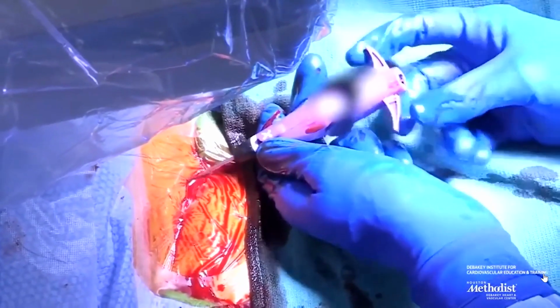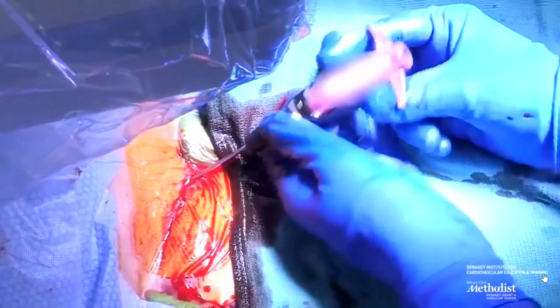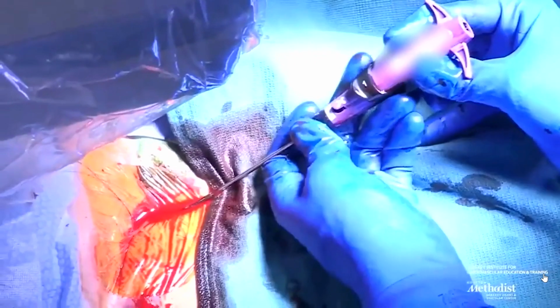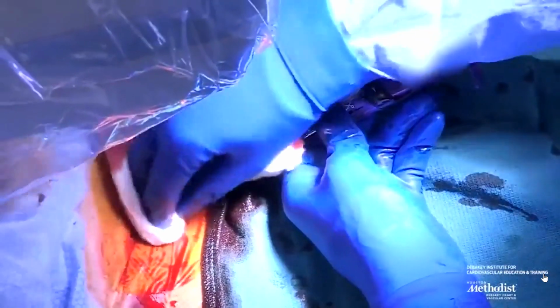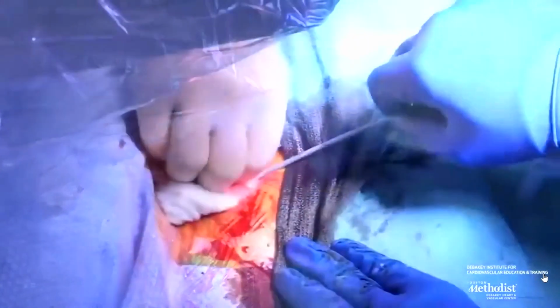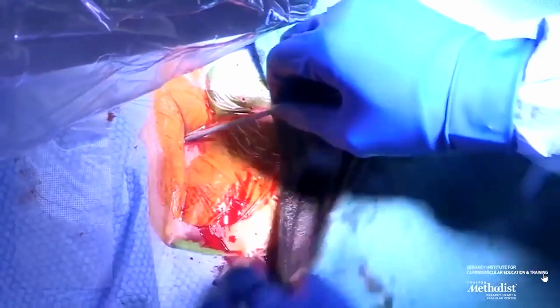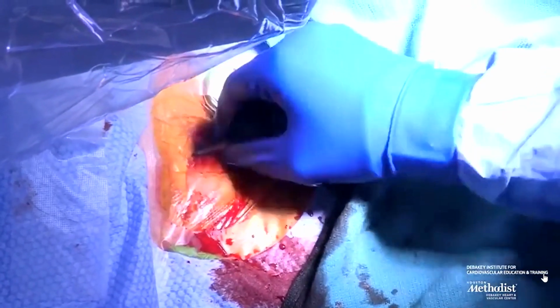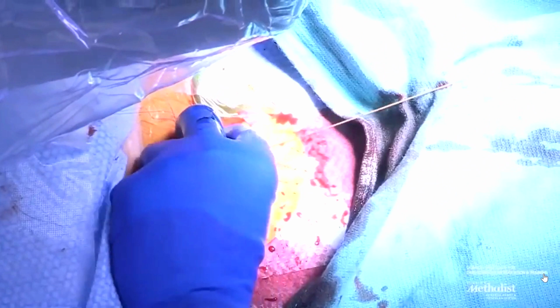And again, we're going to retrieve those sutures after we put the foot pedal down, and then we're going to tape them to the drapes. And we place a wire back inside the ProGlide. You never want to lose access to your artery once you've made a hole in it. Once that wire goes in, then we use a 10 French dilator. We park it past the bifurcation of the aorta. We do this under direct vision, and then we retrieve the wire.